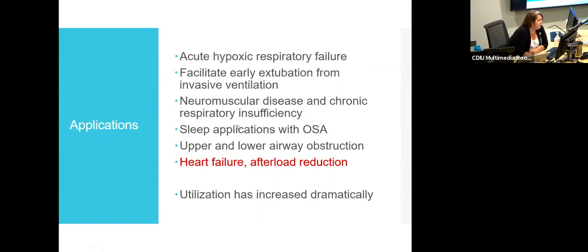We will use non-invasive ventilation sometimes when we have upper and or lower airway obstruction, depending upon what the underlying pathology can be. There are things to consider. And what's pertinent to this talk is that we are going to talk about how we use non-invasive ventilation as an adjunct therapy in heart failure for afterload reduction.